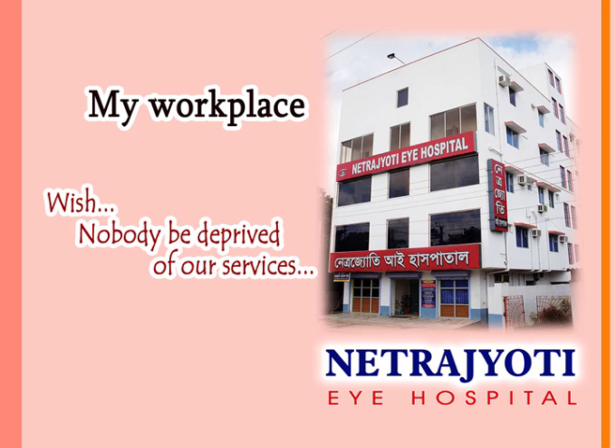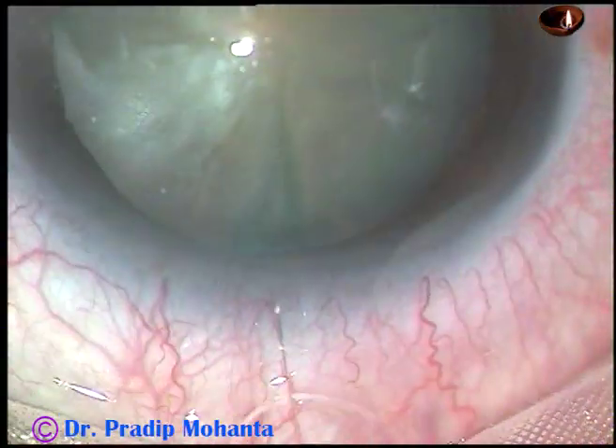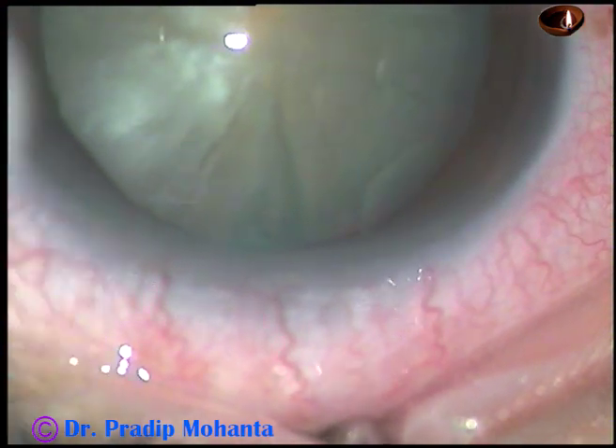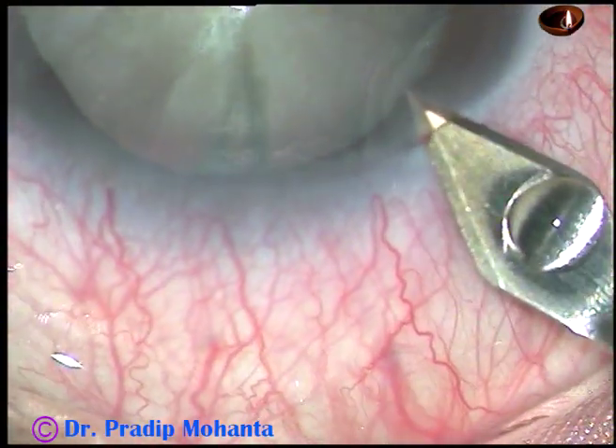Friends, welcome to my workplace at Rana Ghat, West Bengal, India. This is a white mature cataract with convexity of the anterior surface of the cataractous lens. Let us observe this surgery done on 27th May 2018.